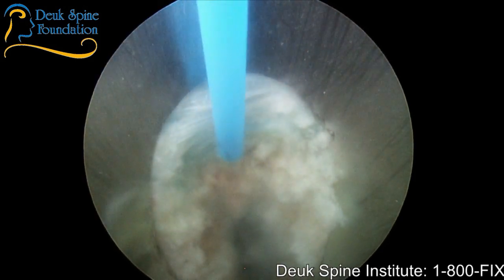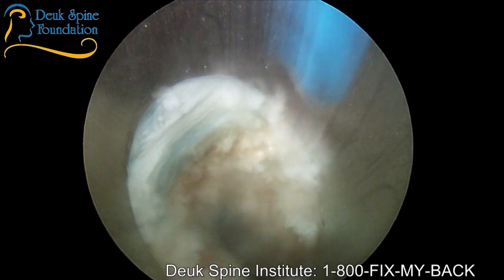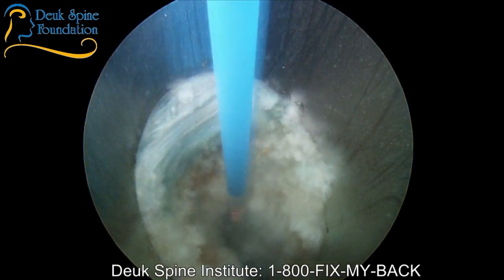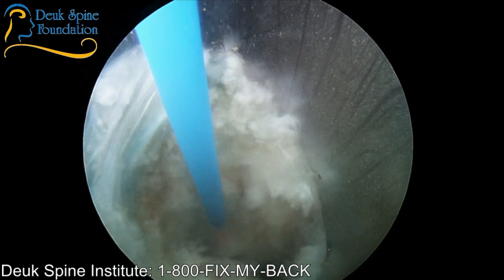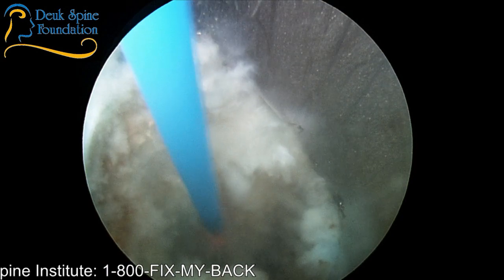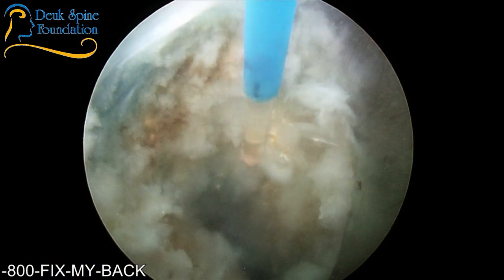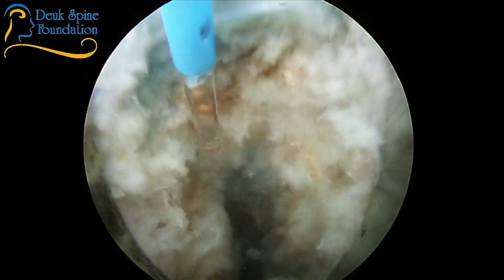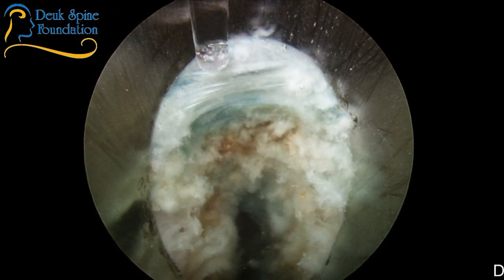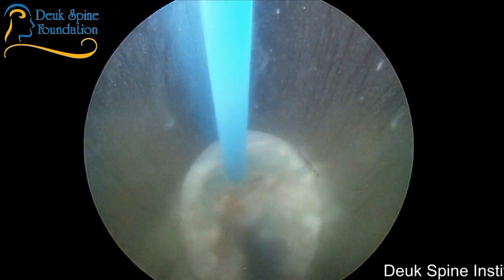And we're right in what's called Kambin's triangle, K-A-M-B-I-N, named after Parviz Kambin. Dr. Parviz Kambin was the first surgeon in the world back in the 70s to do a lumbar endoscopic transforaminal surgery. He was a faculty member at the University of Pittsburgh Medical School. I think he was maybe even at Allegheny. I can't remember exactly where he was, but it was definitely in Pittsburgh. And he was the pioneer of lumbar transforaminal endoscopic surgery that everyone learned from.